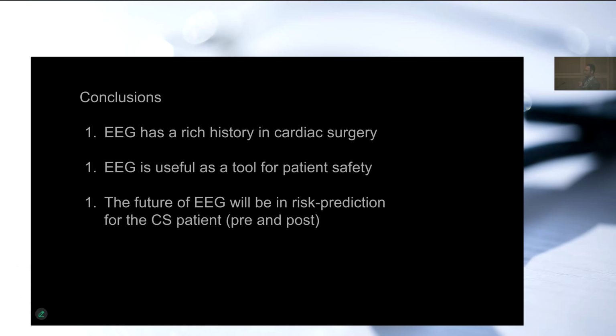The literature in this area was rich in the 1980s. Mike Felder and his friends at Mayo were doing experiments on this very thing to tease out essentially what components of the cellular metabolics, of the brain metabolics, are addressed by anesthetics and addressed by hypothermia. And what they found quite conclusively is that as the temperature drops, especially 10 degrees below normal, so by the time you're at 27 degrees, you essentially have no more electrical activity at all. And so the only thing that's left is cellular function, and your anesthetics do nothing for that.